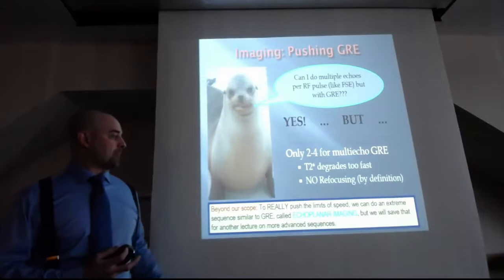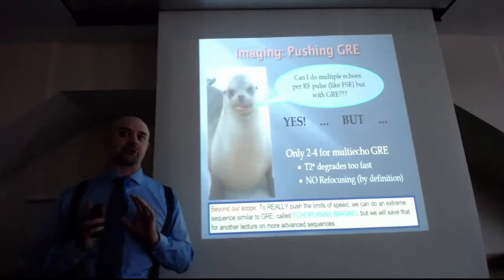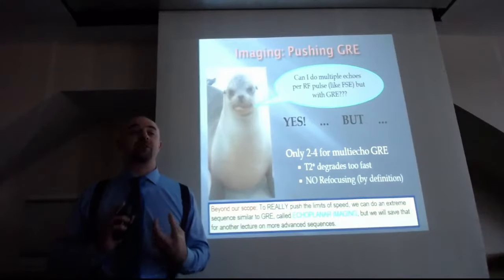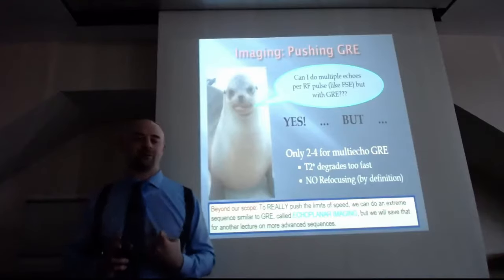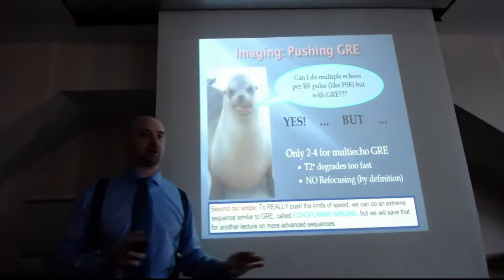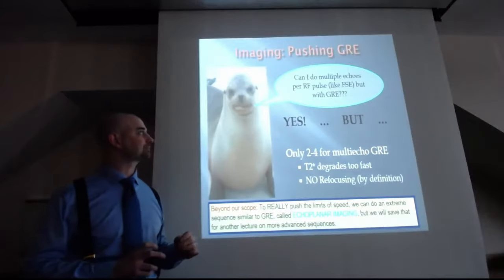Okay. If you really want to push the limits of speed, there's an extreme sequence which is similar to gradient echo imaging in extremis, which is called echoplanar imaging. But we won't talk about that here. I'll save that for the advanced sequence lecture.